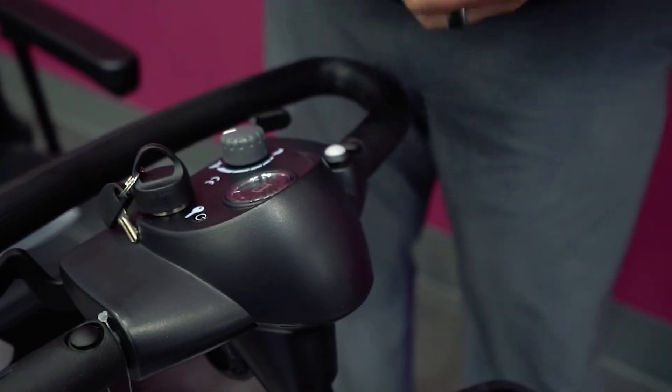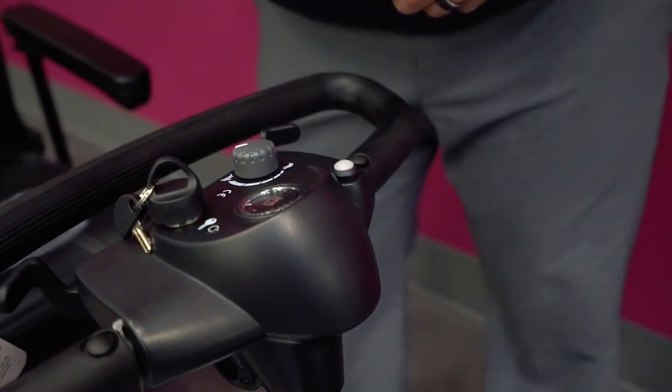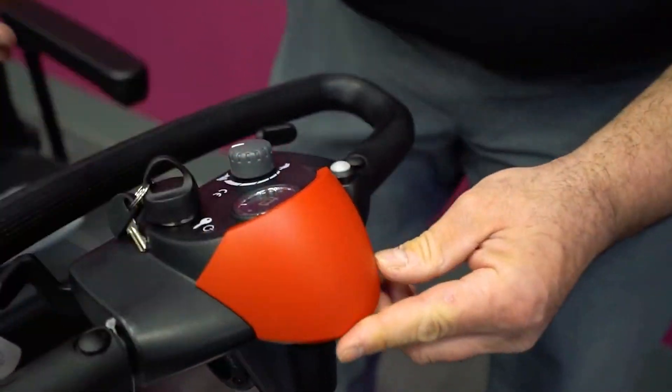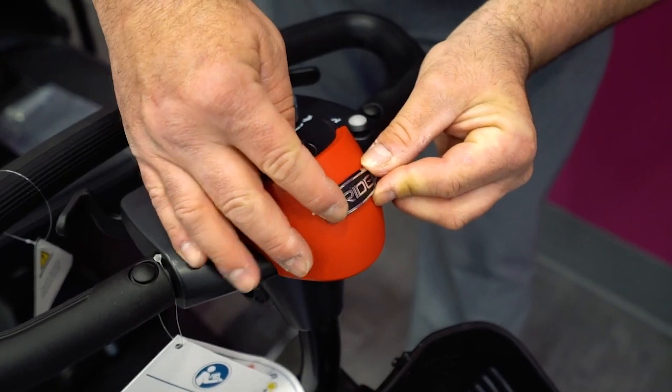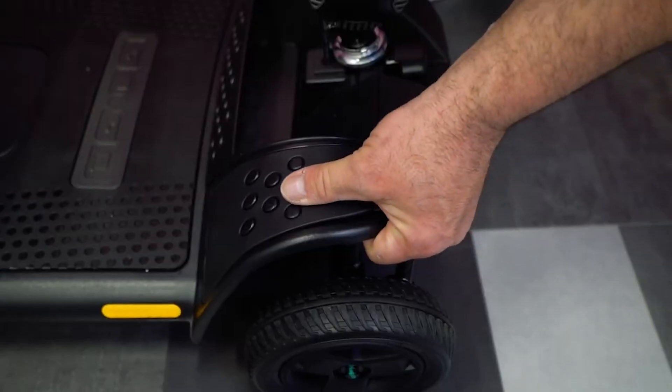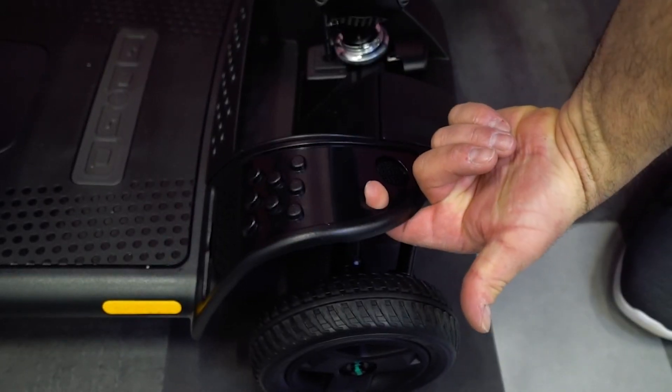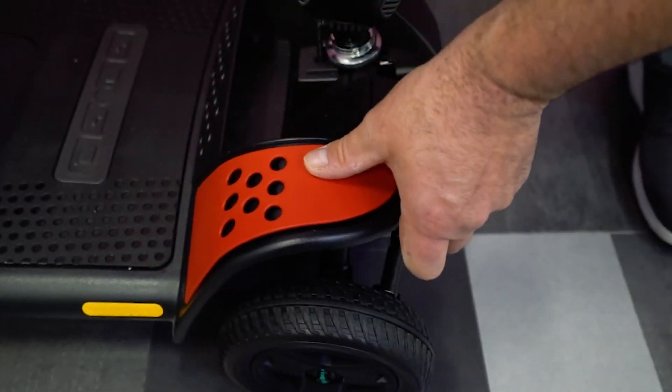Your unit comes standard with interchangeable cardinal red and black shrouds. You can switch out the shroud on the tiller and are provided with an additional Pride decal. Note the two holes where the front shrouds would be located that allow you to remove them easily.